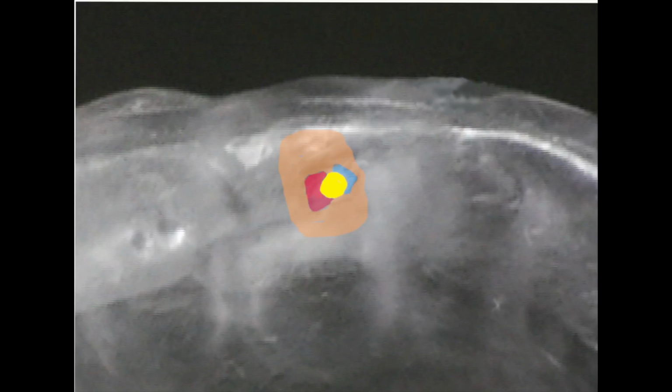The blue and red areas are where you may need to adjust the perimeter wall of the fossa as we achieve centric relation. But remember, never ever deeper than the yellow part. The goal is flat with the plane of occlusion. The orange area is also adjusted to almost flat so that it is never in contact during any excursive movement.